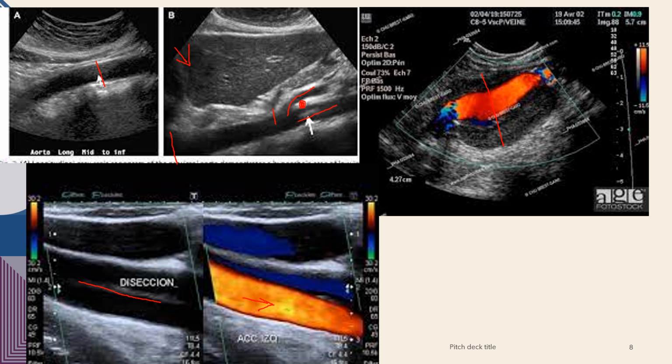This is essential that you have your 2D gain settings set correctly. Now, to be absolutely certain that a patient is not suffering from thrombus or dissection, the best practice would be, after you're completing your scan in long, to come back after you've taken your diameter measurements and just do one more evaluation, putting color flow on that aorta, following it down from proximal all the way to the distal taper, looking for any changes of turbulence or deviation of flow or anything like that.